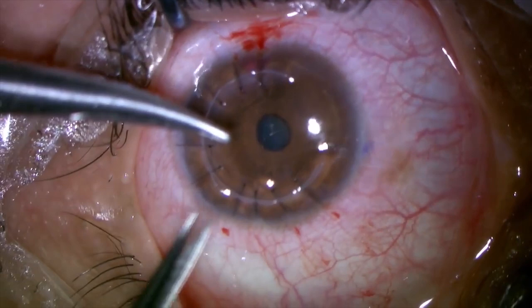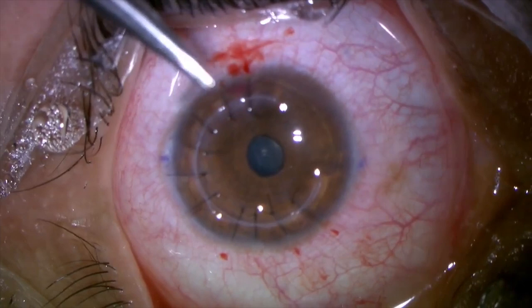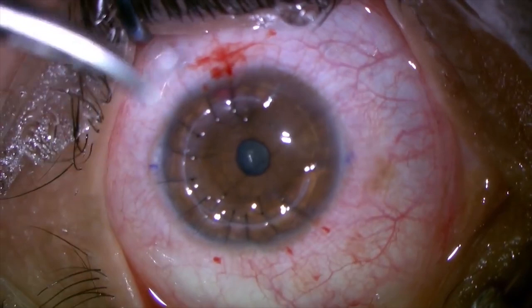Okay, we are here with our surgeon, Dr. Angela Gutierrez. She's a good friend, a good surgeon, and she will show you. Look down, un poquito abajo, por favor. Yes, perfect. Now we are here with Dr. Gutierrez. She will remove the stromal tissues. We are going to explore all the cut, the laser, the circular cut.